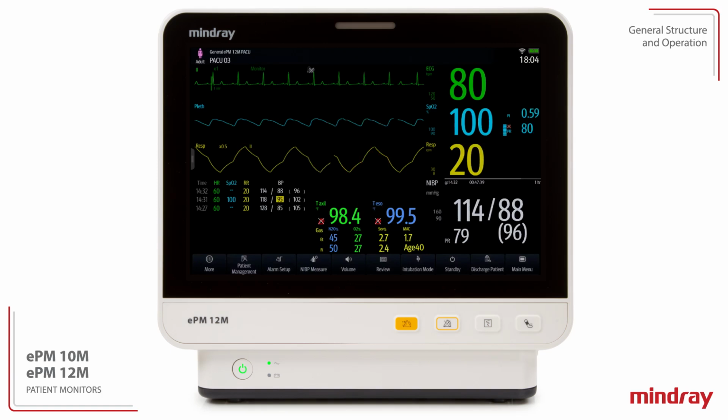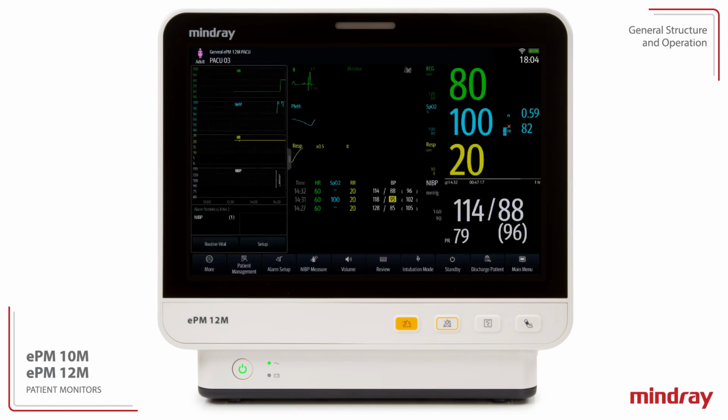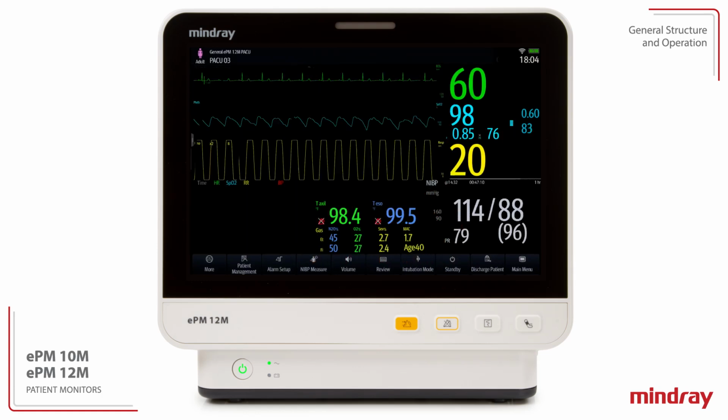For example, the clinician may move from the normal screen to the big numeric screen with a simple 2-finger swipe to the left. Swiping left from the big numeric screen displays the mini trend screen. Swiping again returns the clinician to the normal screen.